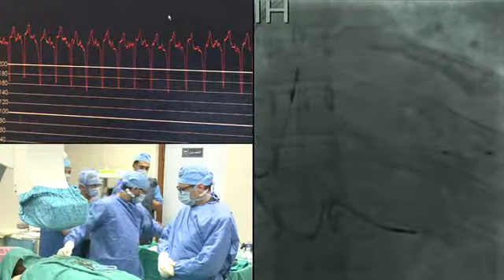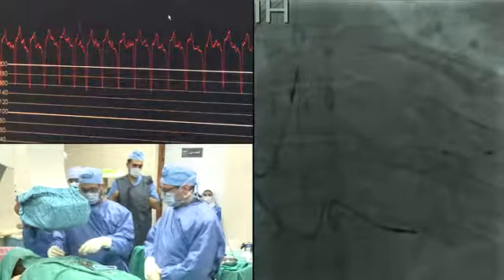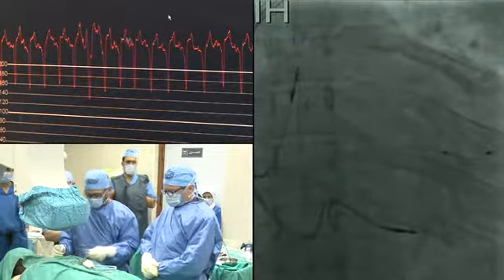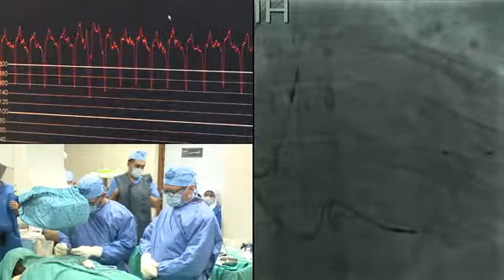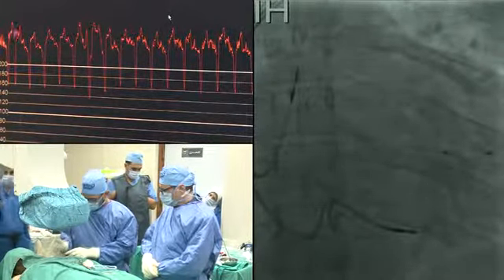This line, typical, if you're washing the pocket? Yeah, for washing the lead. And the lead too, yeah. Atrial first, yeah. I connected the atrial lead first.